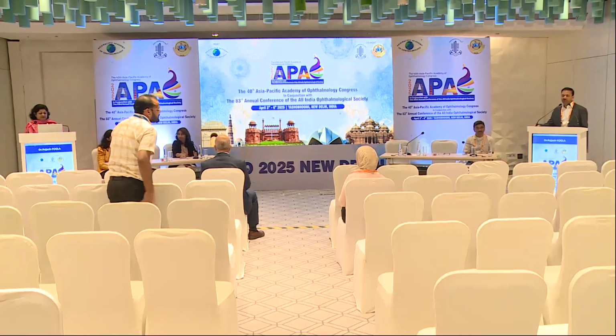Well, you would like to make the incision where the cornea looks almost normal. You need to watch out for, sometimes in elderly patients also you can have variation in the corneal thickness. There may be peripheral guttering or furrow degeneration. So if you are used to doing your standard surgery and you go ahead, you may end up with a problem. But if you feel the cornea is quite involved, and if the conjunctiva is normal, I will open the conjunctiva and make a scleral incision, because scleral incisions are more robust in terms of they withstand the manipulation better. And at the end of the surgery, you can close the conjunctiva so your incision gets covered with that.